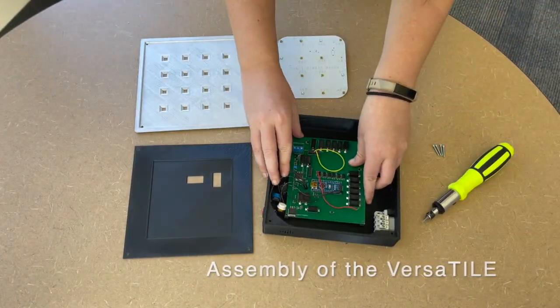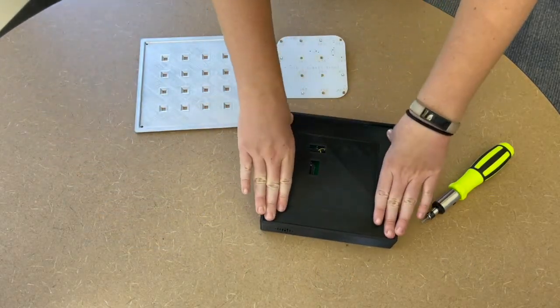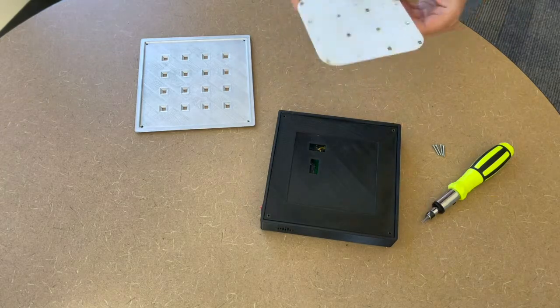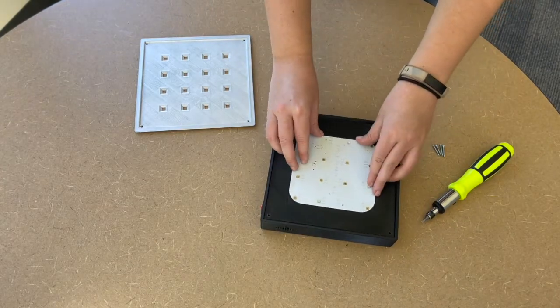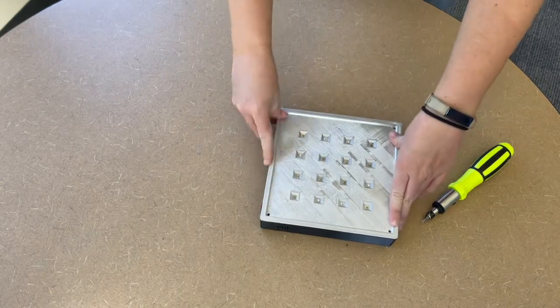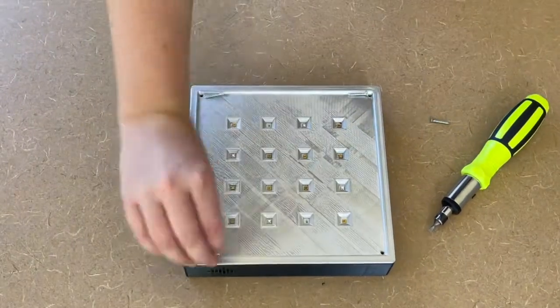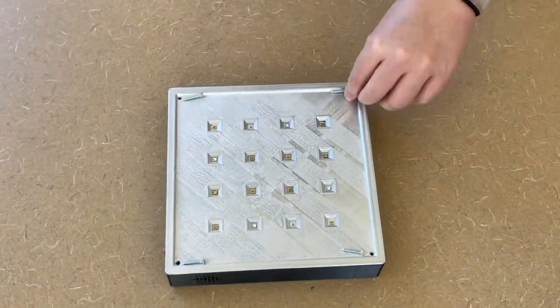The layer structurally supports the UV light matrix's UV LED PCB and provides protection for the microcontroller PCB in the casing. The cover sits right on top of the UV LED PCB and layer, only exposing the UV LEDs. The cover screws onto the layer and casing, securing all components of the Versatile's enclosure.